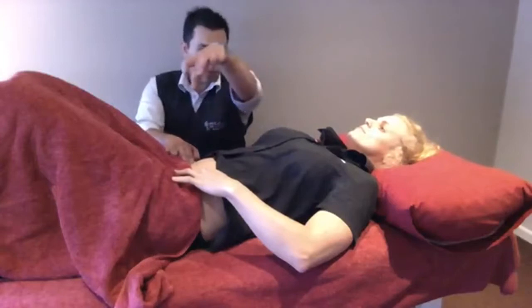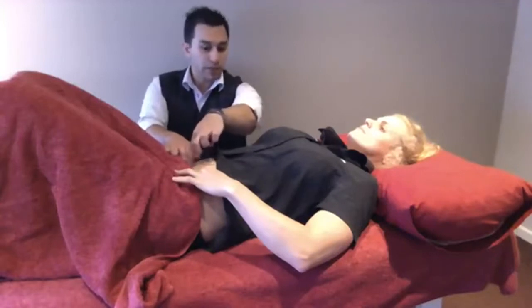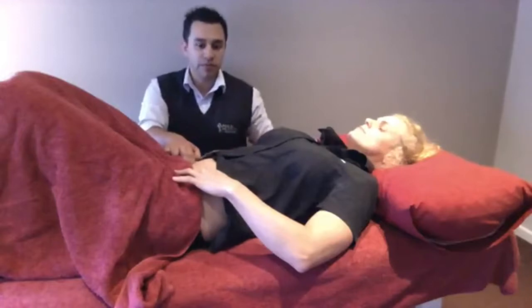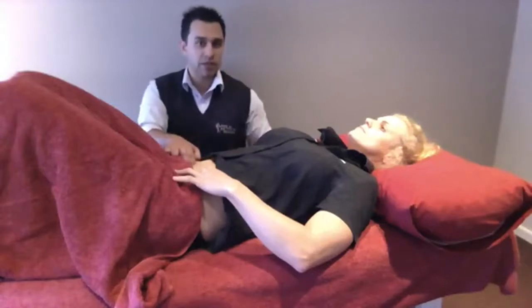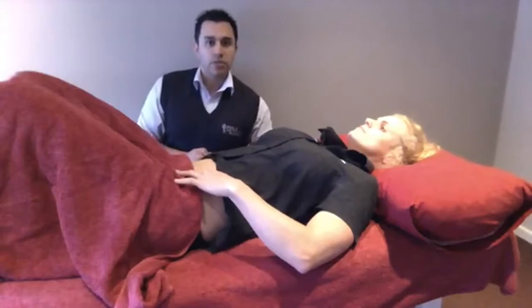What you do want to feel is these two bones being pulled together that way. So to do that, imagine you've got a belt buckle on, and you're just trying to pull that belt buckle — but only that belt buckle — down towards your spine. Just drawing in nice and slow, drawing on a little bit more, and relax. I can see a little bit of upper abdominal activation there, so just think about all the muscles underneath your belly button. Again, just drawing on nice and slow, a little bit more. Good, very good. You'll just feel the muscle kind of swell underneath your fingertips. You want to hold that for 10 seconds, 10 times, twice a day.